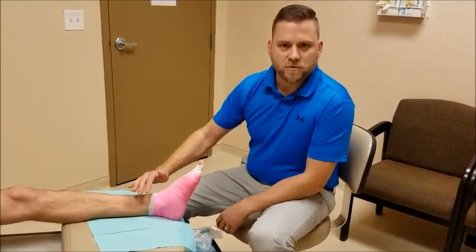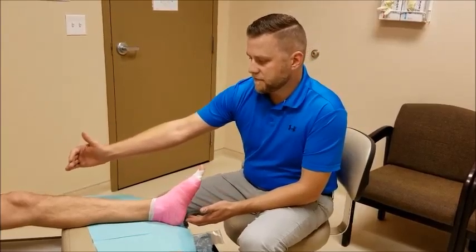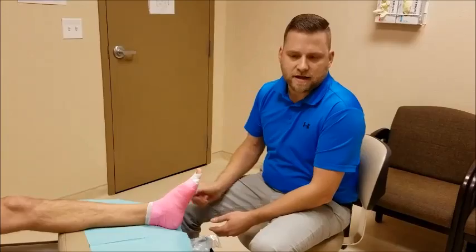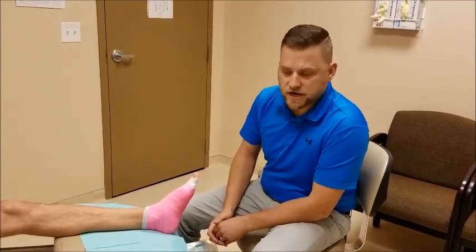Here at Foot and Ankle Associates, we put patients in dressings after surgery or a wound, and often after a fracture or another surgery, they'll be in a cast. In those cases, you don't get your foot wet, so you have to cover your foot when you go into the shower.